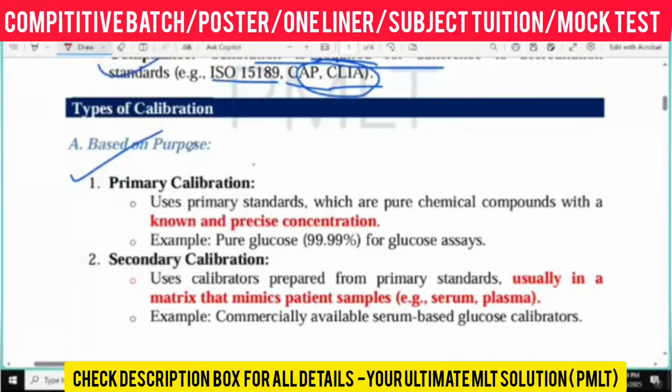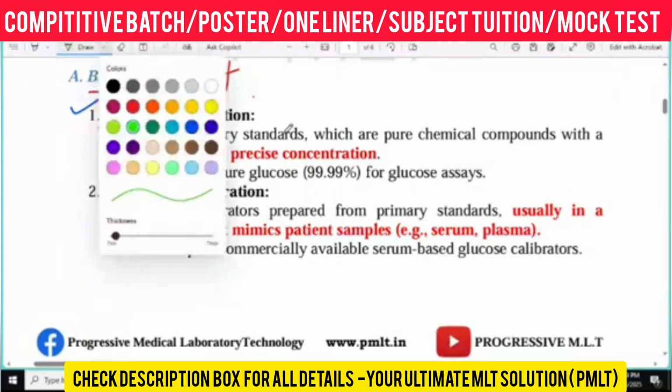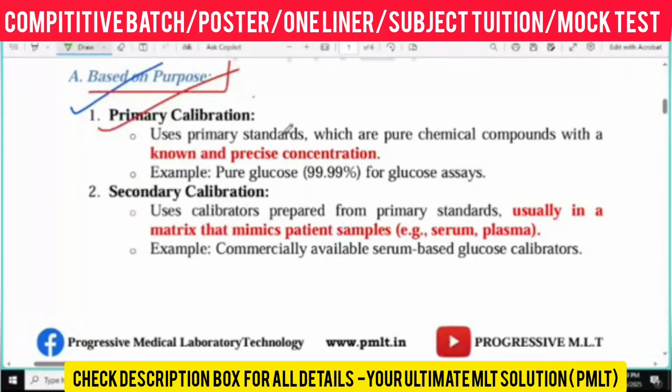See, now we are understanding the types of calibration based on the purpose. See here, the first type is based on the purpose: primary calibration. What is primary calibration? Primary calibration uses the primary standard, which is a pure chemical compound with a known precise concentration.